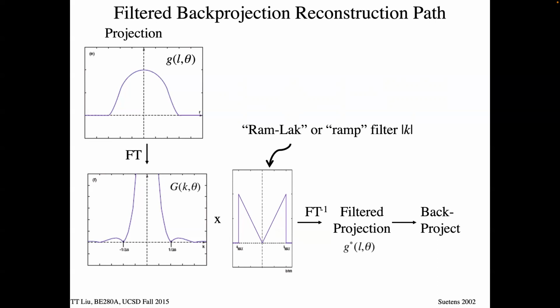Is it a smart thing to do, abruptly truncating the data like that? It's a terrible thing to do. It's a really bad idea. But if it's noise-free data and everything's perfect on your scanner, that is the way you get the actual image back. The true image is this transformation. So if everything's noise-free, like, say, the head phantom. It just dropped out of my head. I've only known that for 30 years.